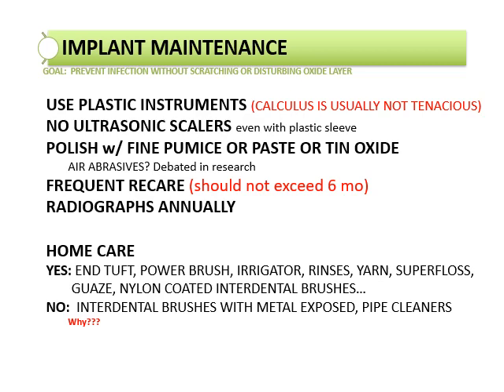Yeah, there's home care. There's lots of things that we can recommend to our patients. The Superfloss, I think, is the #1 thing. We'll see some pictures in a minute that show you some other dental aids to recommend. So why not an interdental brush with the metal, like a proxy brush that has metal going through it? Well, because it can scratch the fixture. The scratched fixture can lead to bacterial growth. The bacterial growth, again, can lead to peri-implantitis. So we just have to be really careful what we clean and poke around our implants with.